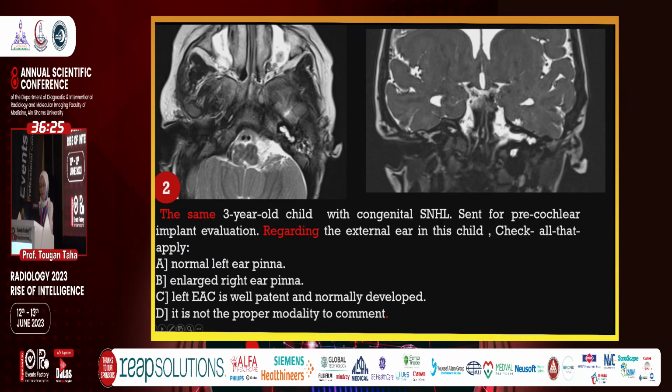Developed? It is not the proper modality to comment. Please answer.